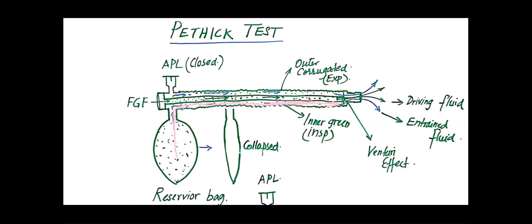That is why this reservoir bag collapses. The gases passing through the inner inspiratory tube act as the driving fluid, and the gases from the outer corrugated tube and the reservoir bag are the entrained fluid.